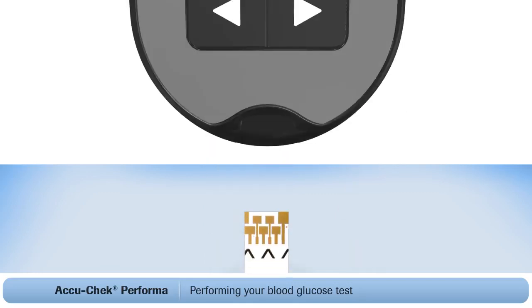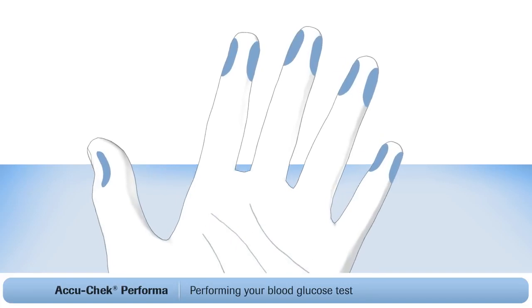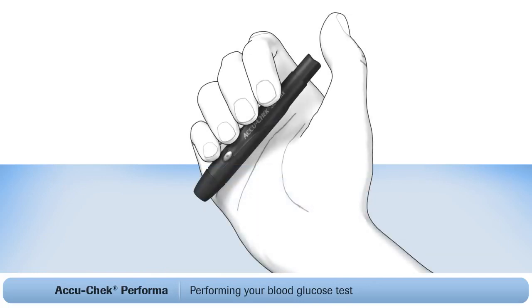Now insert the test strip, gold end first, into the meter. Then a small flashing blood drop symbol will appear on the screen. This tells you that the meter is ready to test. When lancing my finger, I always use the side of the finger rather than the tip, as it's more comfortable and less sensitive. Now prime the lancing device.